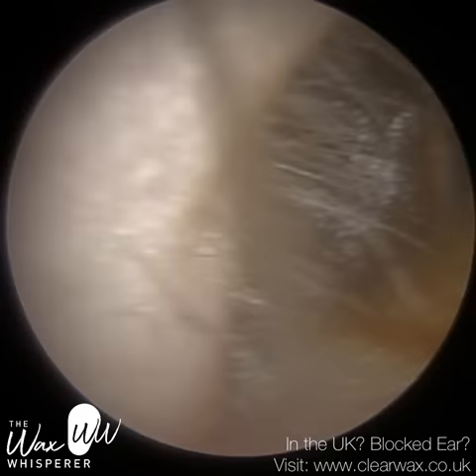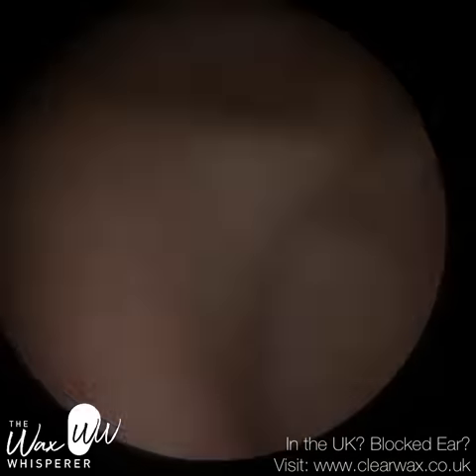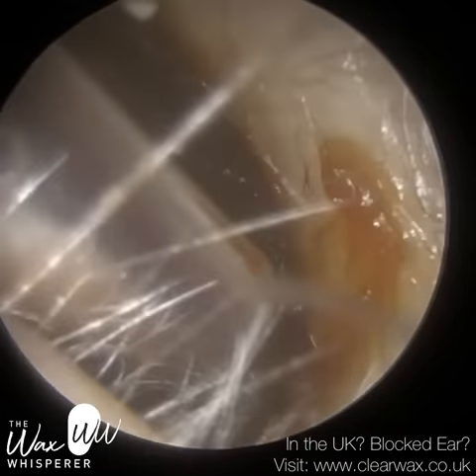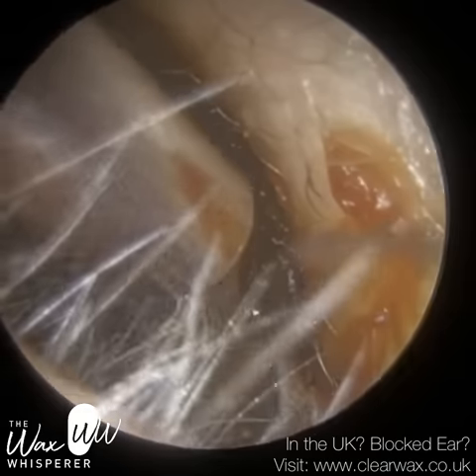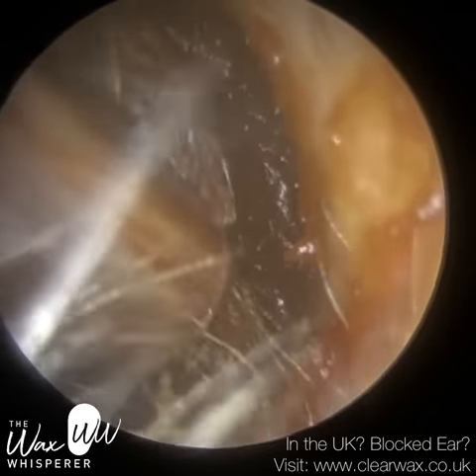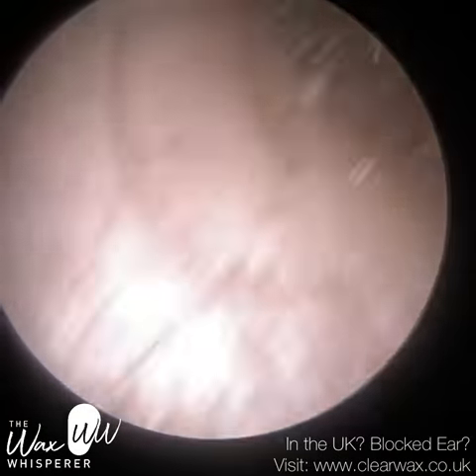We have a patient here who attended with a blocked right ear, so this is their right ear. The earlier clip was of their left ear. There was some wax, but it was non-occluding wax — it wasn't affecting the patient. It was near the entrance, it was on its own way out, and the eardrum was fully visible. Most importantly, the patient didn't report any symptoms there. So we're just focusing on this right ear.